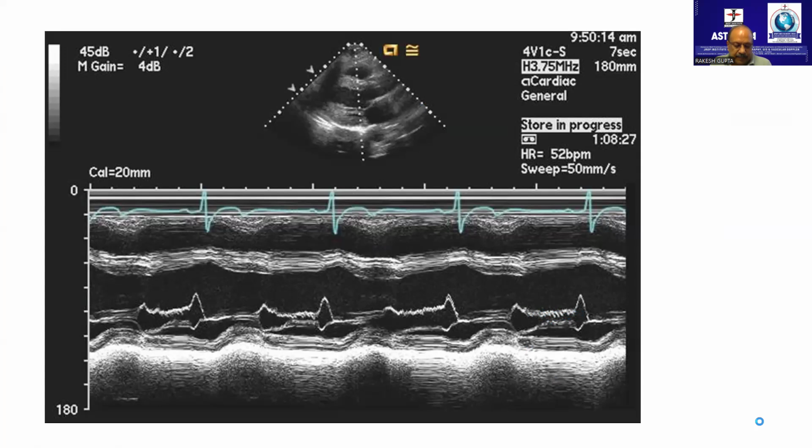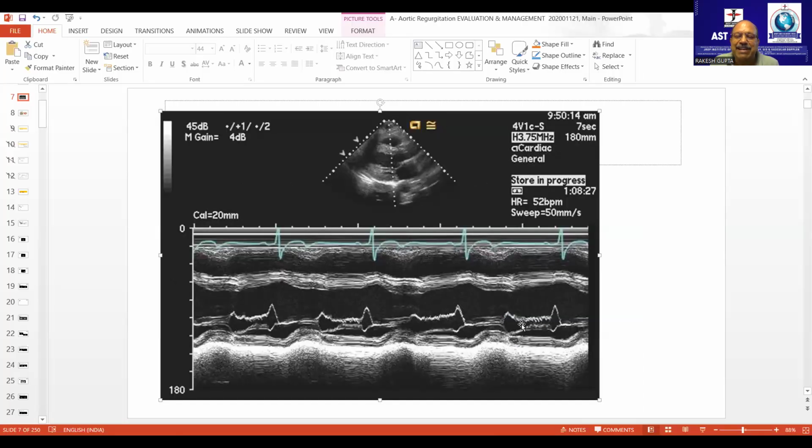Clear? So the cursor should be at the mitral valve and not the aortic valve. If the cursor were at the aortic valve, how would the aortic regurgitation jet produce this sawtooth appearance? It is the sawtooth of the anterior mitral leaflet, AML fluttering, and it is only present when the jet is striking back towards the AML. It can go towards the interventricular septum also. The problem with aortic regurgitation is that the jet could be eccentric.